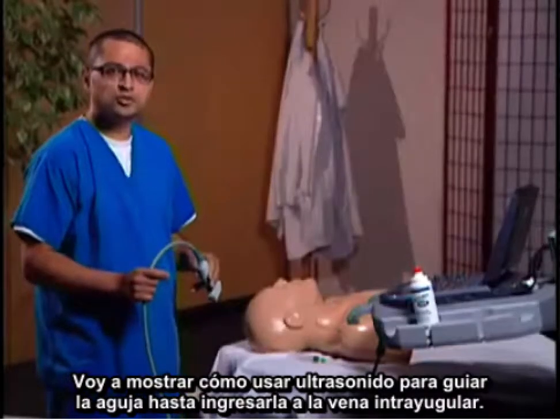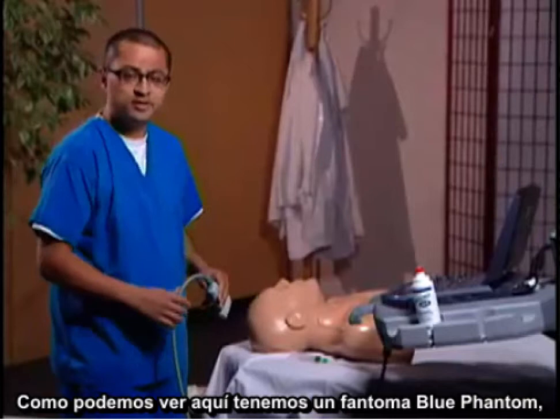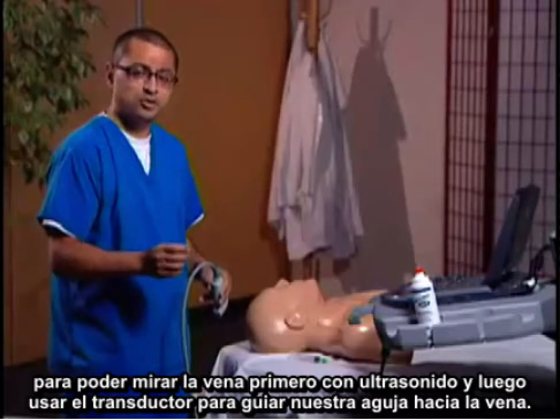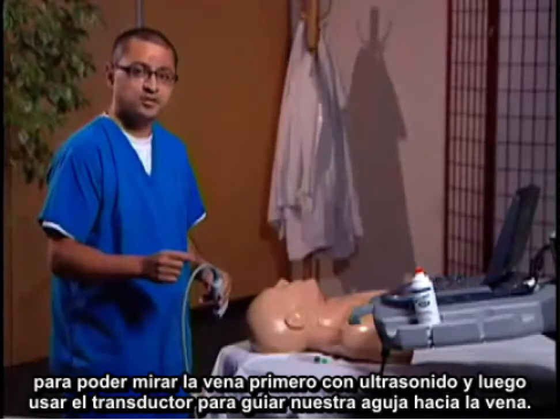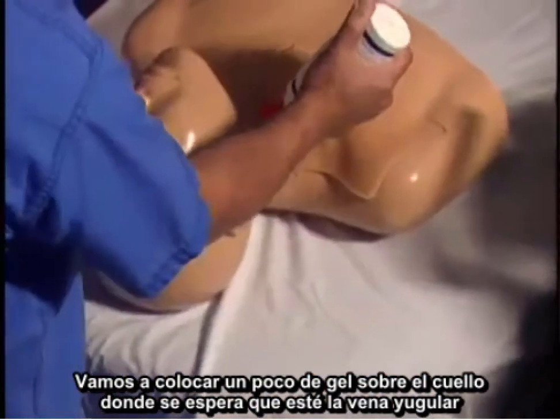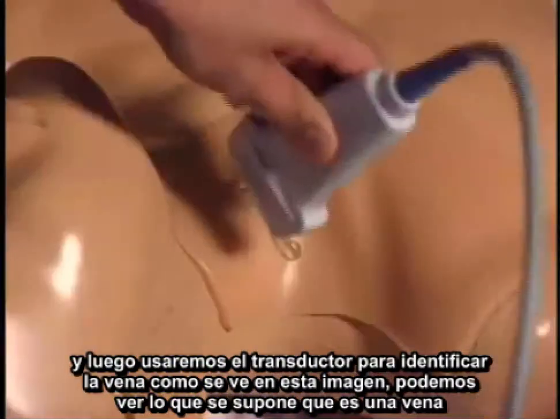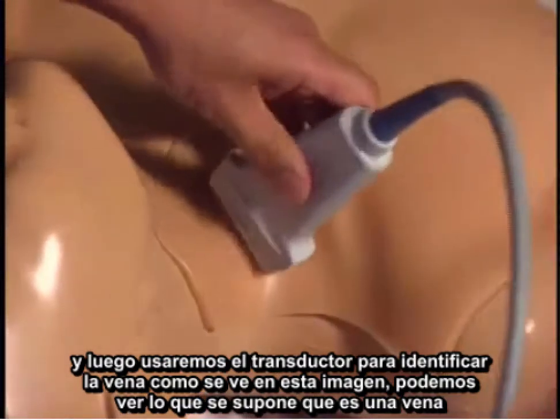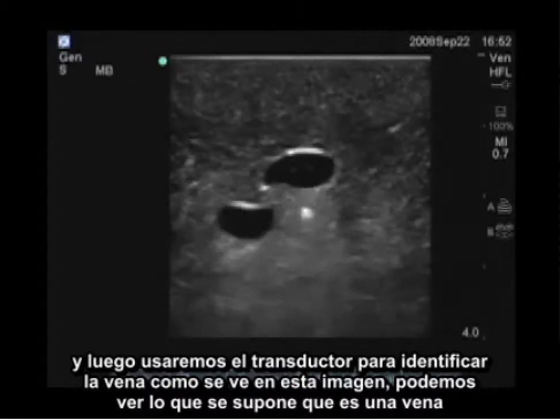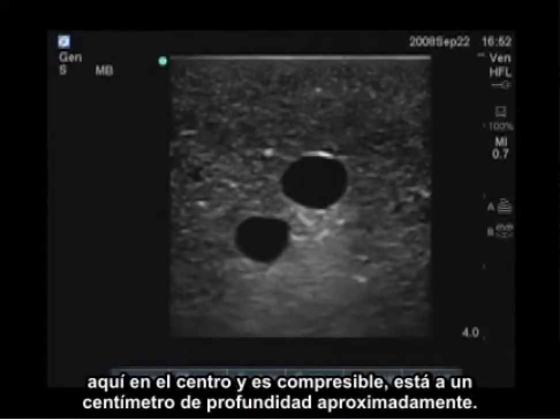I'm going to show you how to use ultrasound to actually guide your needle into the internal jugular vein. As you can see, we have a blue phantom here. We're going to be able to take a look at the vein first with ultrasound, and then I'm going to use the ultrasound transducer to actually guide my needle toward the vein. I'm going to go ahead and place a little bit of gel onto the neck where I expect the jugular vein to lie. And then I'm going to use my transducer to identify this vein. And you can see on this image, we can see what is supposed to be a vein here in the center, and it's compressible. It's about 1 centimeter deep or so.